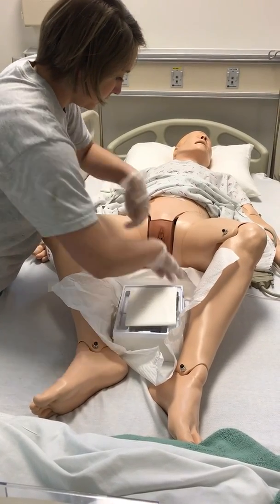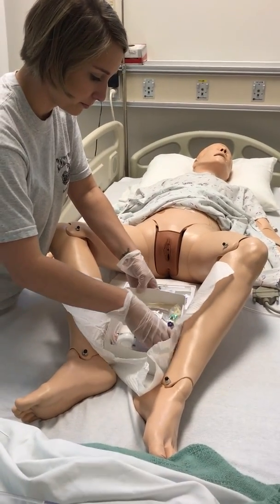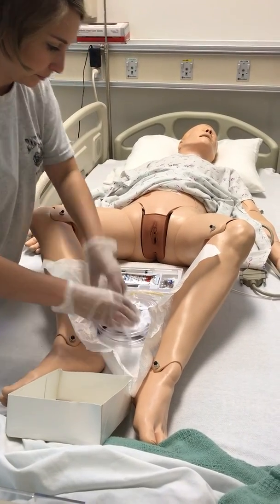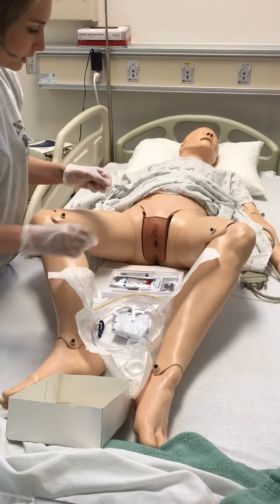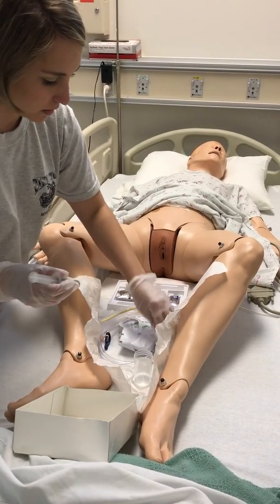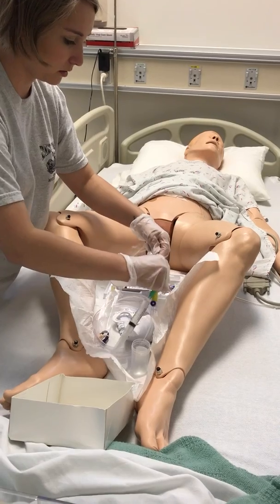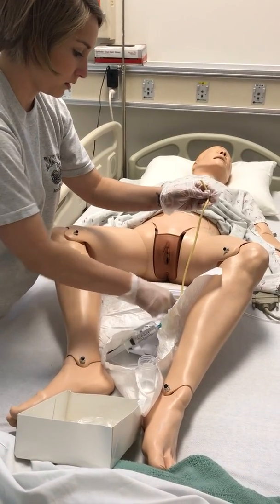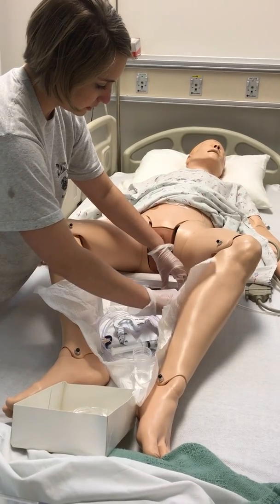I'm going to take and hold this up under your bottom here. There we go. This is the trash, okay, so it's down here. I have to get a specimen. Before I begin, I'm going to open up my swabs, open up my lube, take this and attach it. I'm going to take and put this in my lube — there we go — and that's just going to sit in my lube.